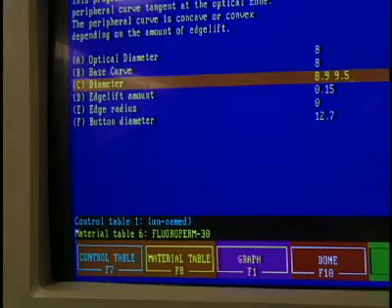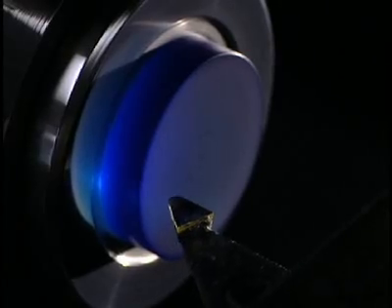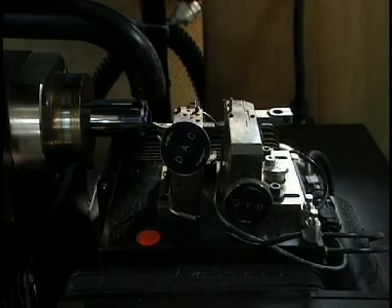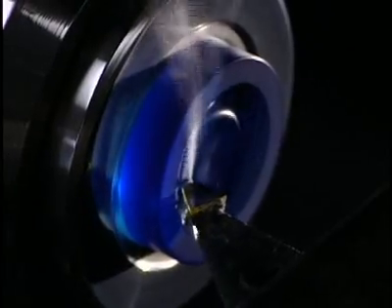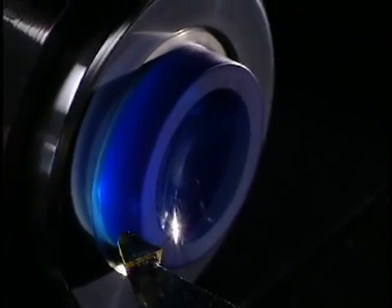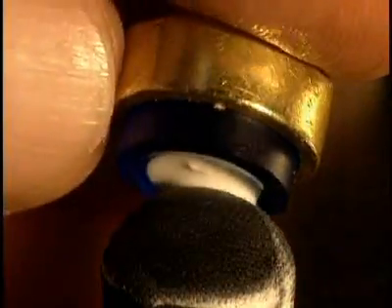The process begins with data processing control of the shaping. Data is supplied by a computer which controls a digital lathe. They begin by shaping the inner curvature of the lens. This digital lathe, rotating at 6,000 revolutions per minute, is equipped with an industrial diamond. It shapes the inner surface — the part that touches the cornea.